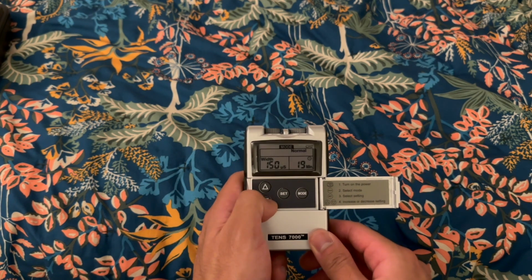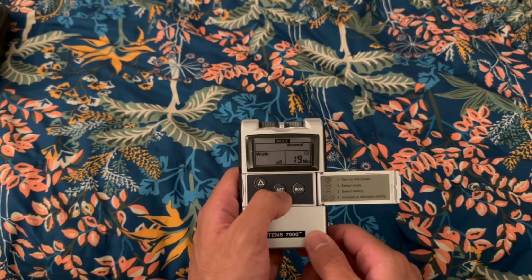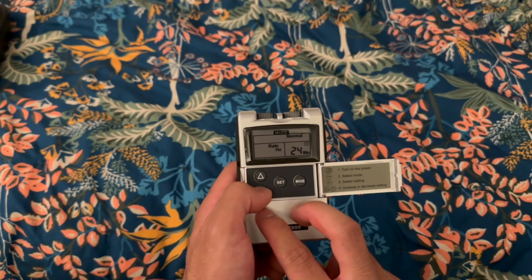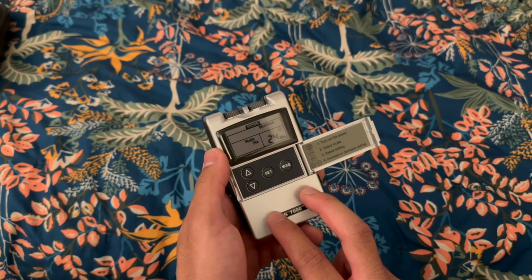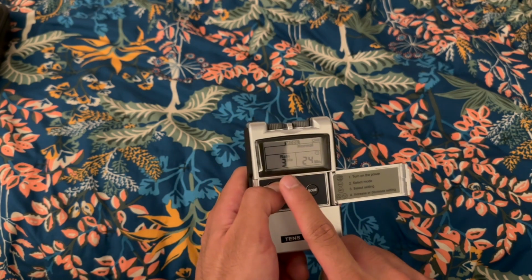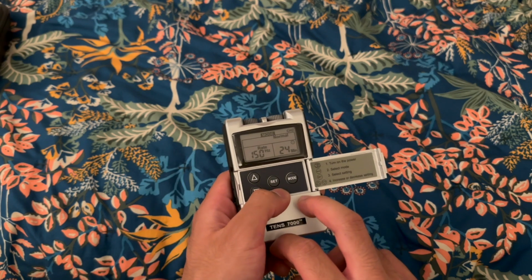But for the sake of conventional, we'll go ahead and be around the range of 50 to 100. Today, we'll keep it at 100. We'll go ahead and press with rate. Rate is pretty much the frequency, how fast something is going to be sending to us. If we're all the way down here with 2, it's sending very small bits of taps going on. But if we go all the way back up to the 150, it's going to be very, very fast taps, just like that. That's how fast the stimuluses are being sent.